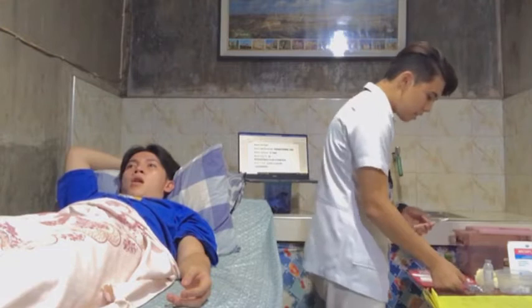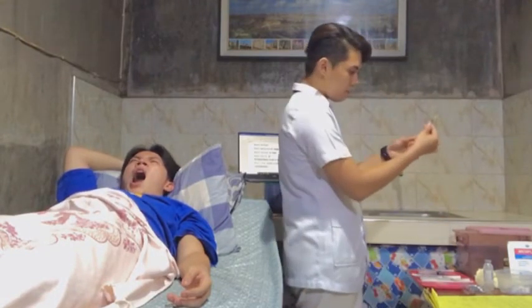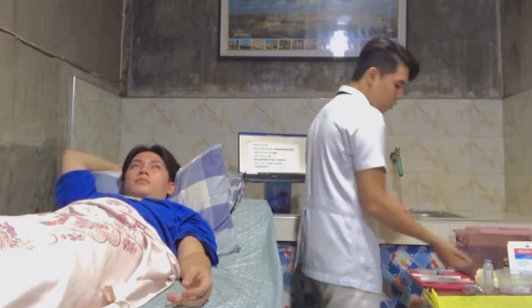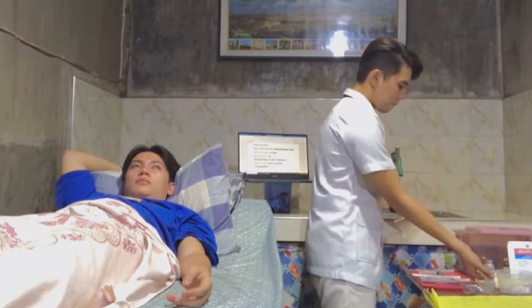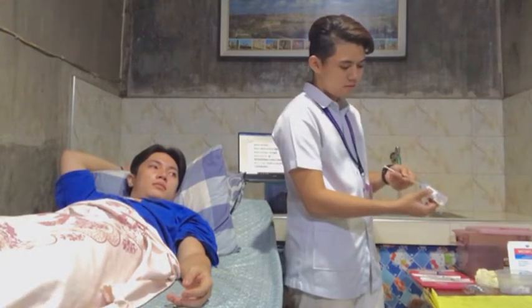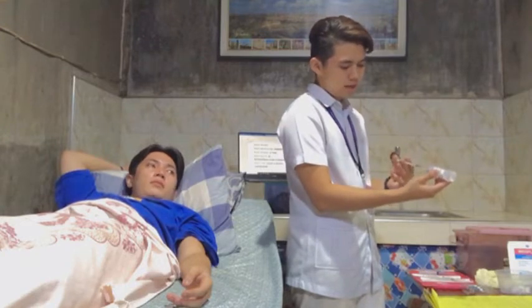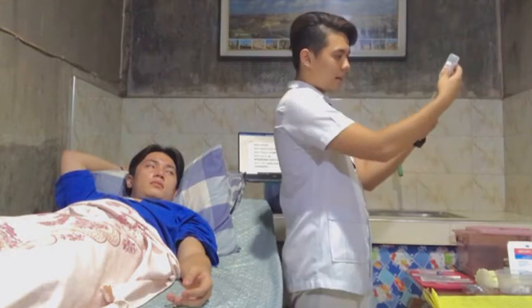And this will be the aspirating needle. Of course, draw up some air. It will be 0.75 ml. Get your paracetamol vial, this one here, and then push the air, and then that's the time that we will be withdrawing the medication.